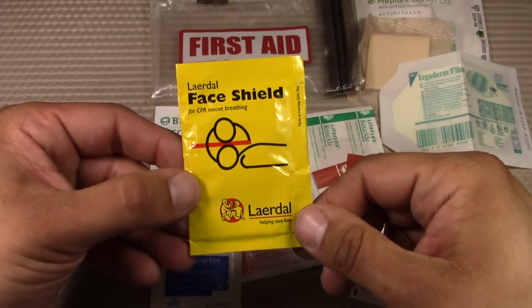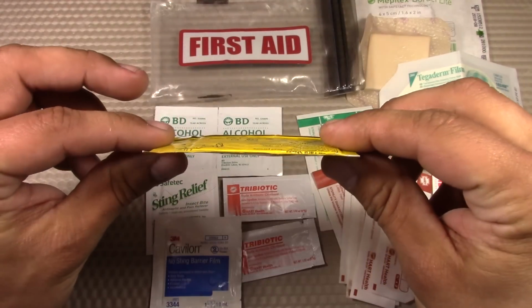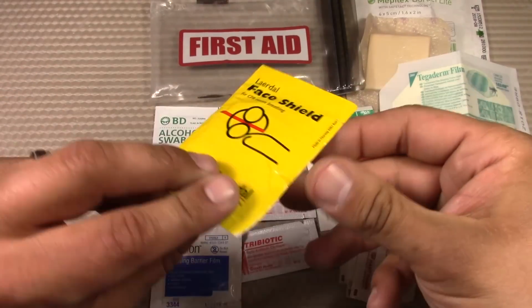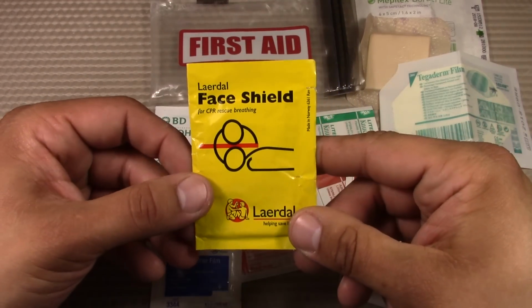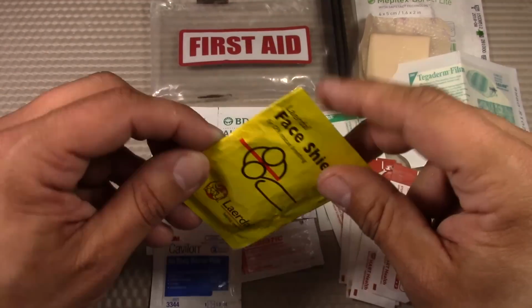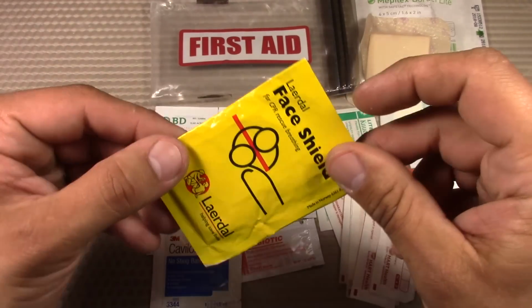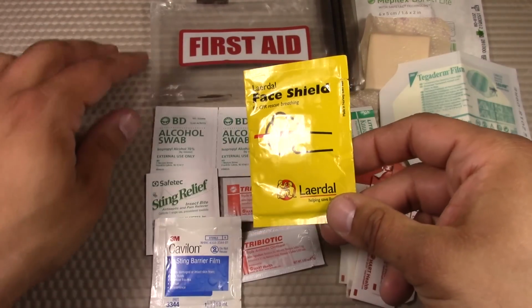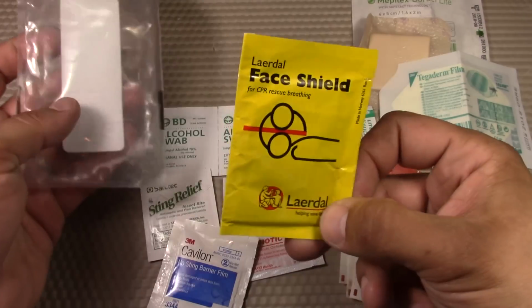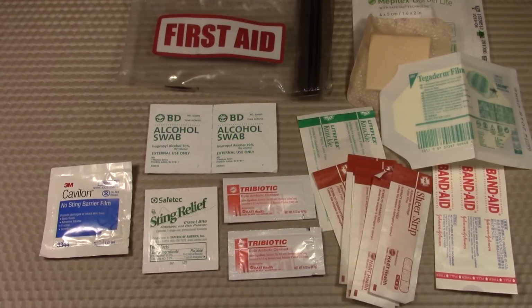Next, I have a CPR Mask. This is a very thin one that you could get individually. You can find them at REI. It provides the instructions on the back there. I take a CPR class every 12 to 18 months. I think this particular brand is pronounced Laerdal, and I just really like it because it's individually wrapped and it folds thin. And I usually have this stored on the outside of the Mini Medi, so it's easily visible too. So a CPR mask.